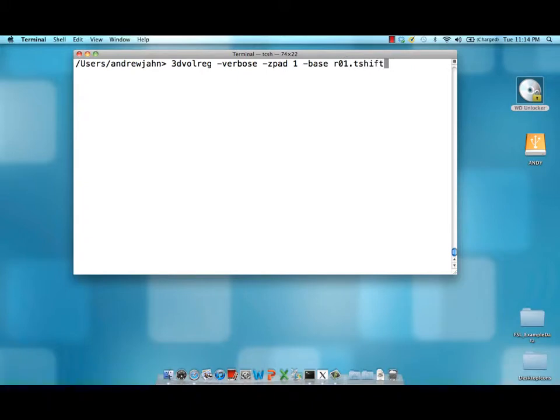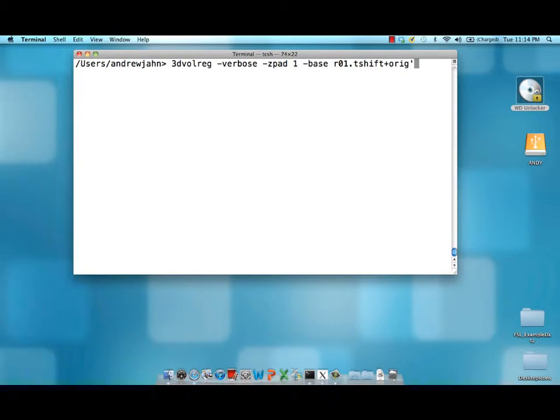We are using a dataset that has already been sliced time corrected. It's called r01.tshift and it's still in original space. There were 165 volumes in this run. It starts at zero so that's why it goes up to 164 at the very end.